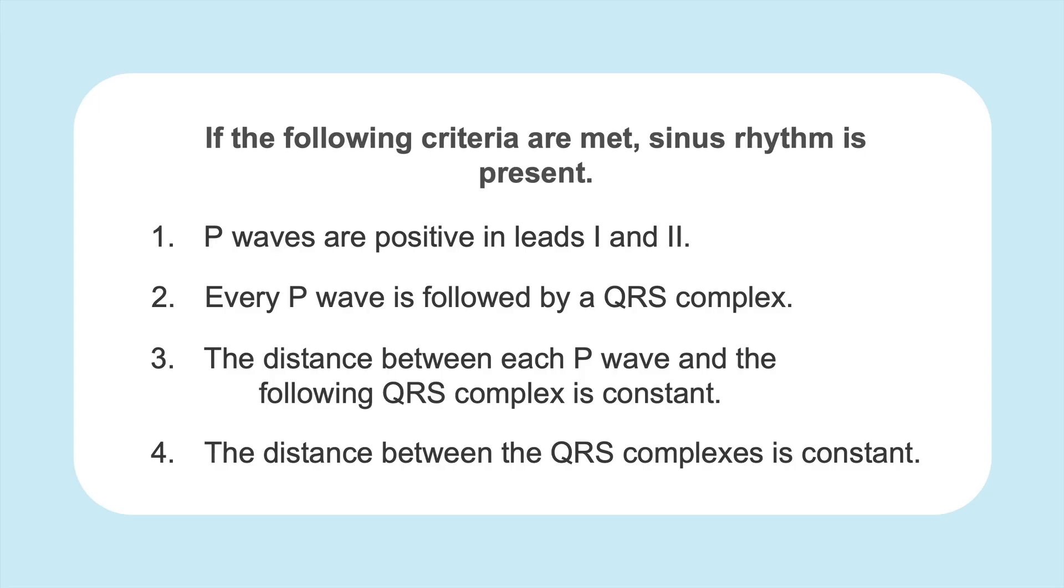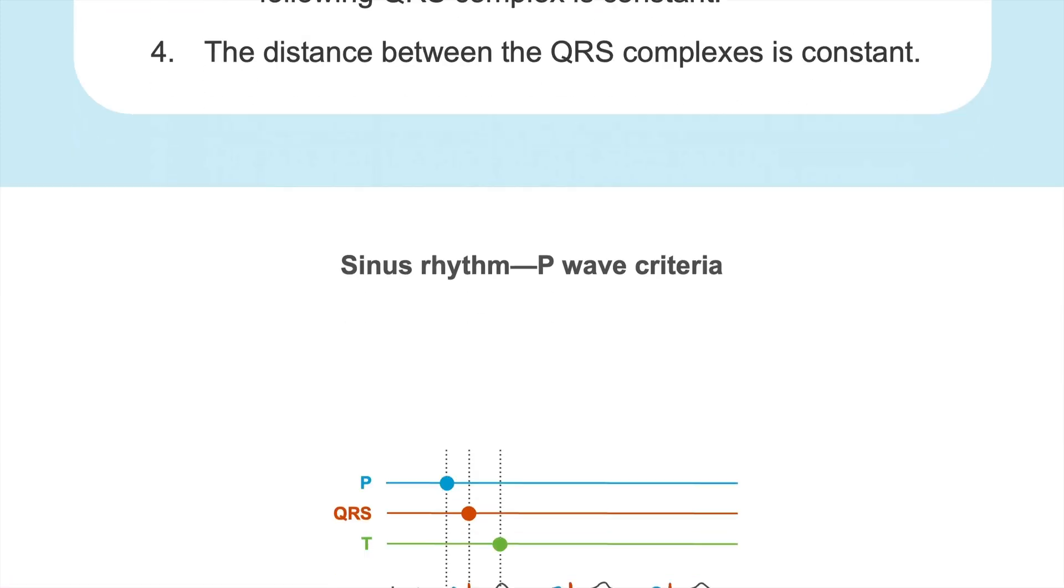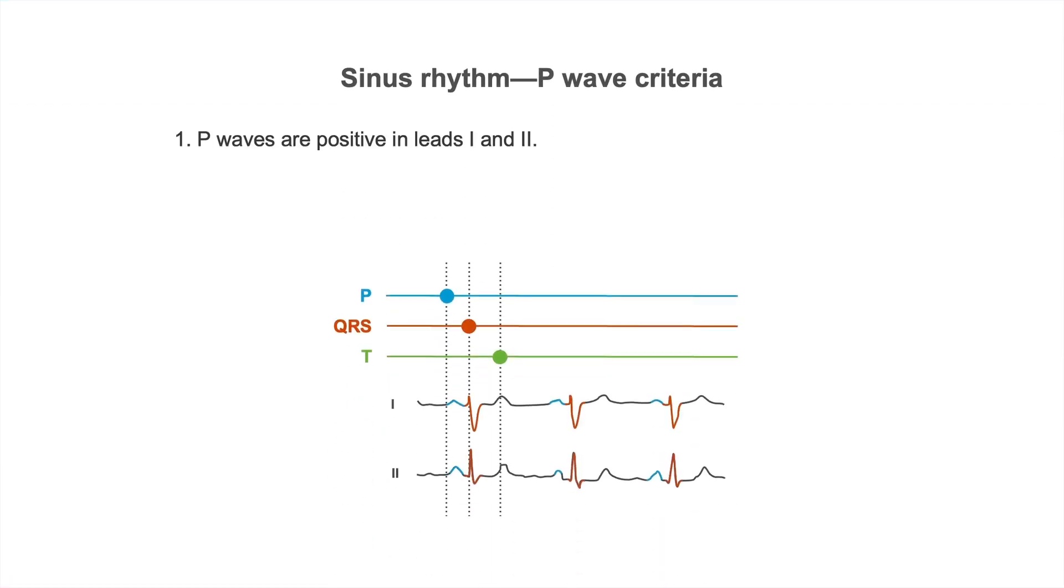As we know, they're essential to diagnosing sinus rhythm. So we said that P waves are positive in leads 1 and 2 in sinus rhythm. Let's check. They're positive in lead 1 and also in lead 2 here. Criteria number 2 says that every P wave is followed by a QRS complex, and that's definitely the case here.